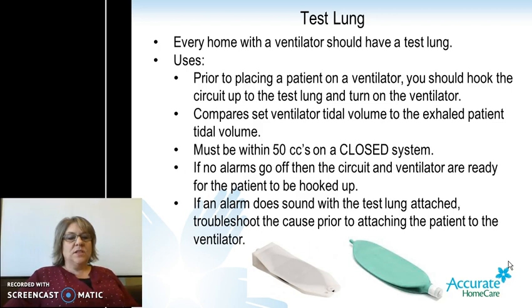What you need to do first is hook up the test lung, let it run for a few minutes, and then hook the patient up after no alarms have gone off.